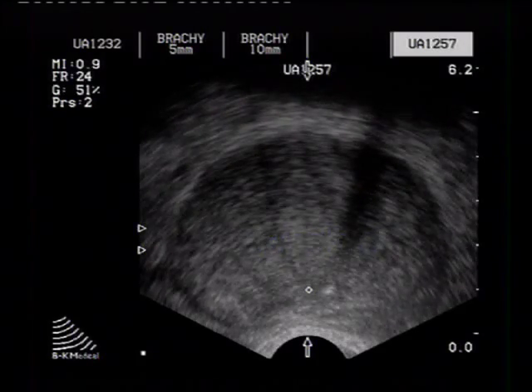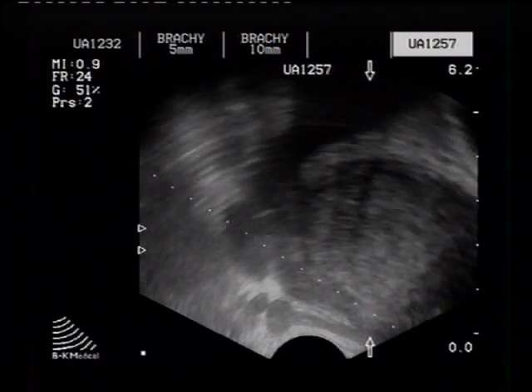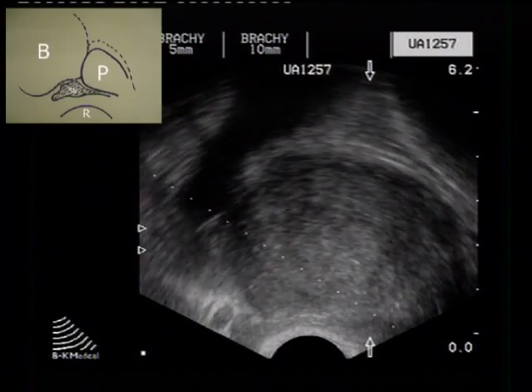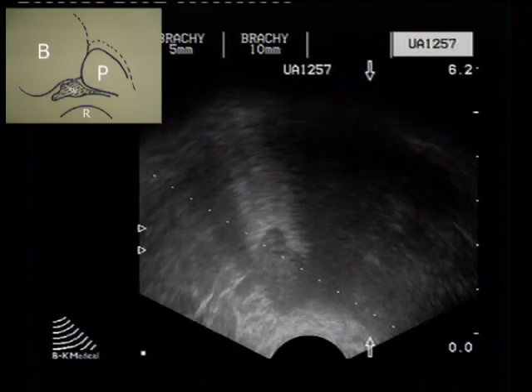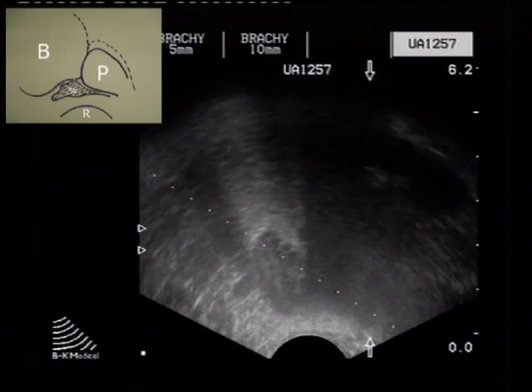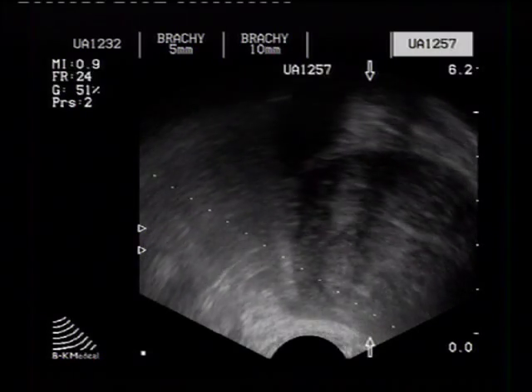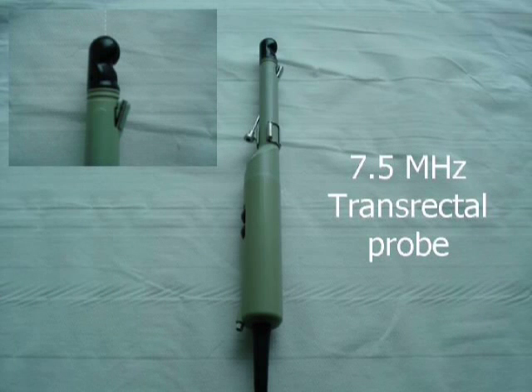Evaluation is performed both in transverse and sagittal views. We use a 7.5 MHz transrectal probe which can scan both transverse and sagittal views simultaneously.